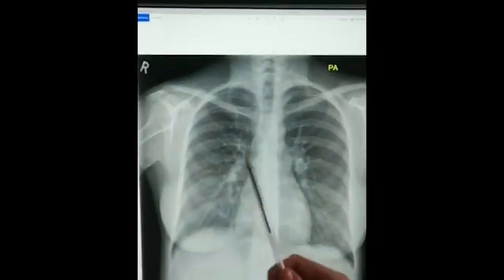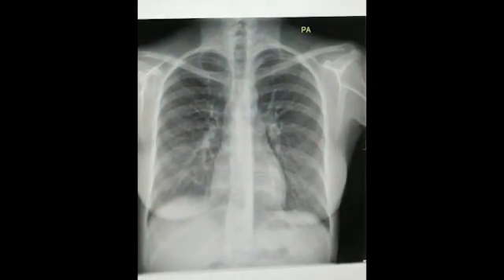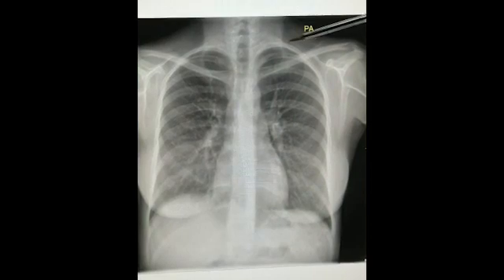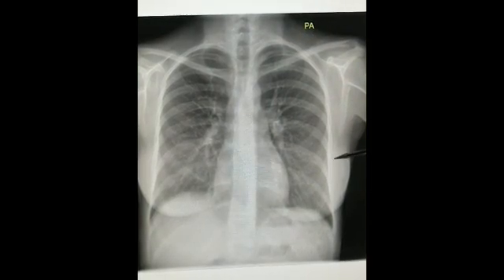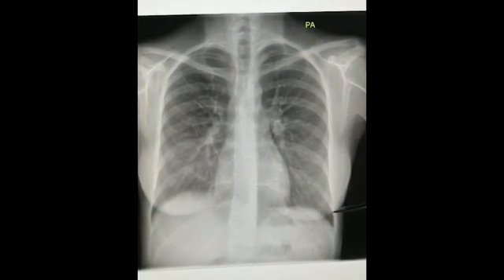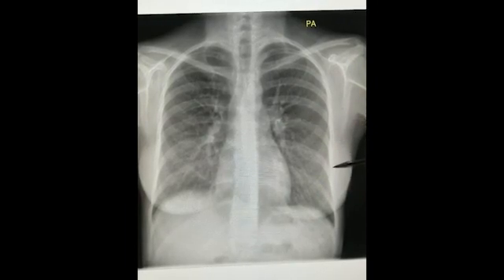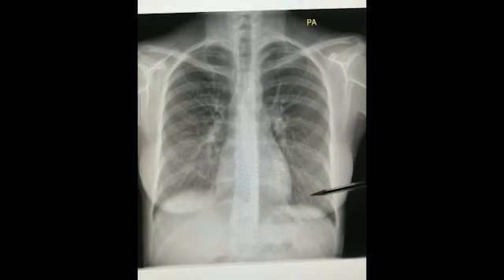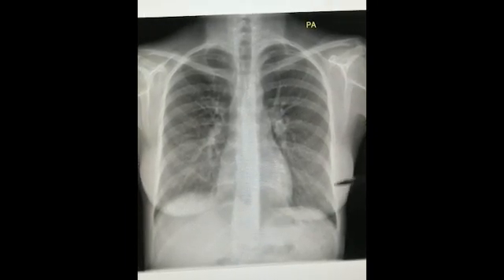So this is the normal chest radiograph — lovely clear lungs with nice lung markings both sides. Importantly, you can see nice and clear in the mid and lower zones, those ribs: the posterior part, the lateral part, and the anterior part, really crisp.